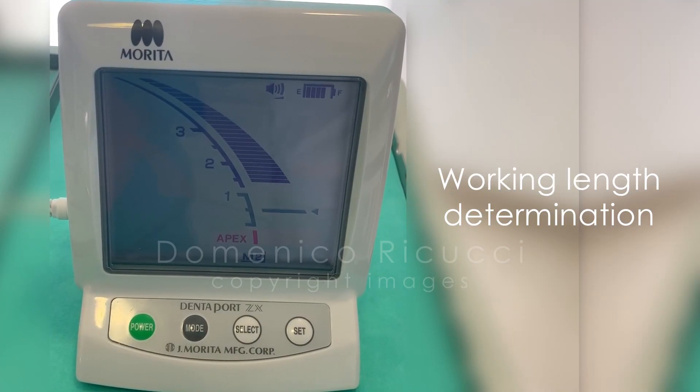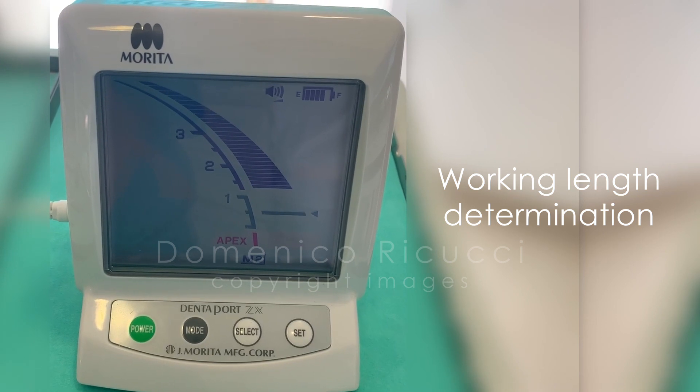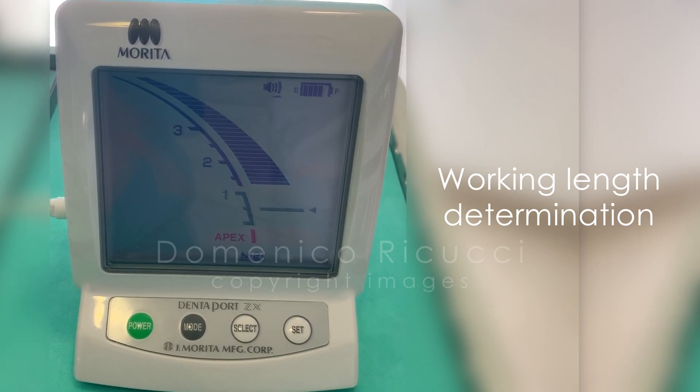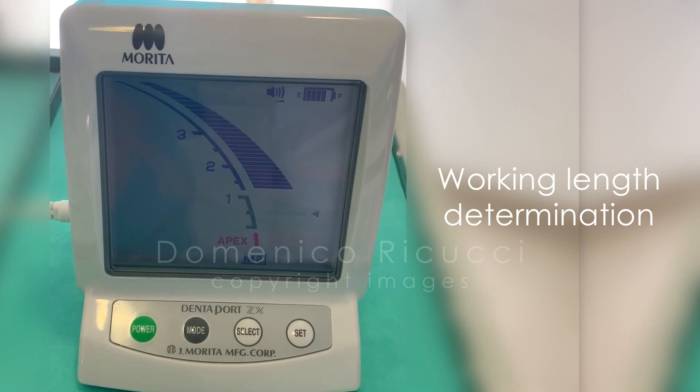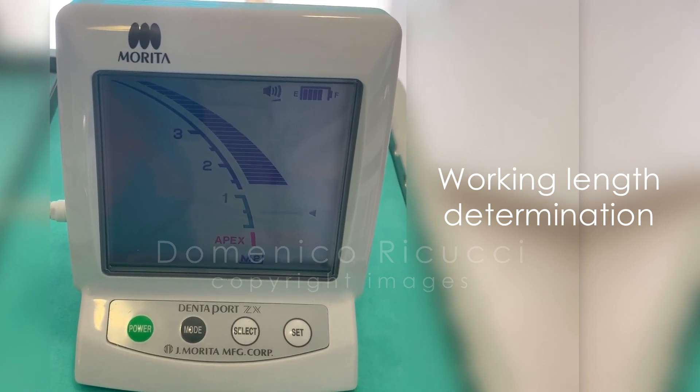Establish working length at the apical constriction — at the end of the blue scale if you use the Morita device.